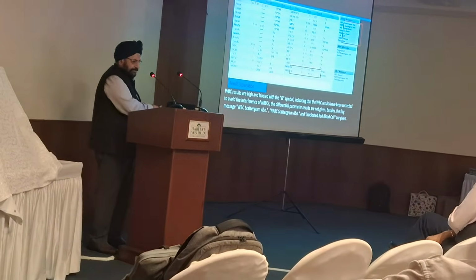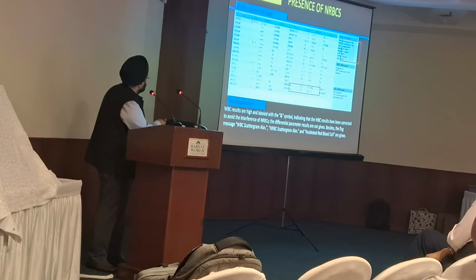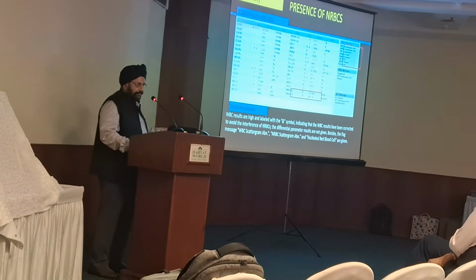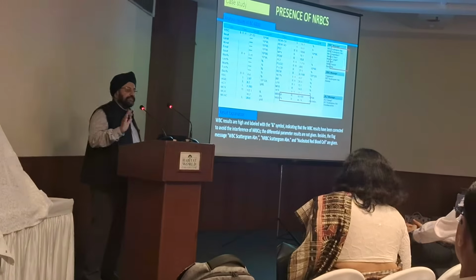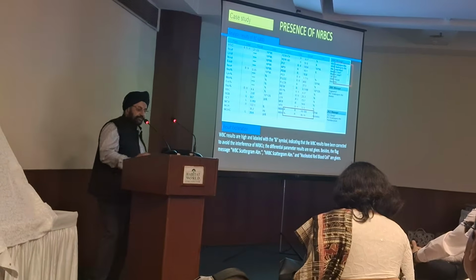This is the case. You can see that the moment it shows this NRBC sign, the WBC has already been auto-corrected. We look at the nucleated RBCs, and even there is a flag. You can see that there is a flag of immature granulocytes and there is a flag of abnormal WBC scattergram, which means that the WBC scattergram is abnormal and something needs to be done about it.